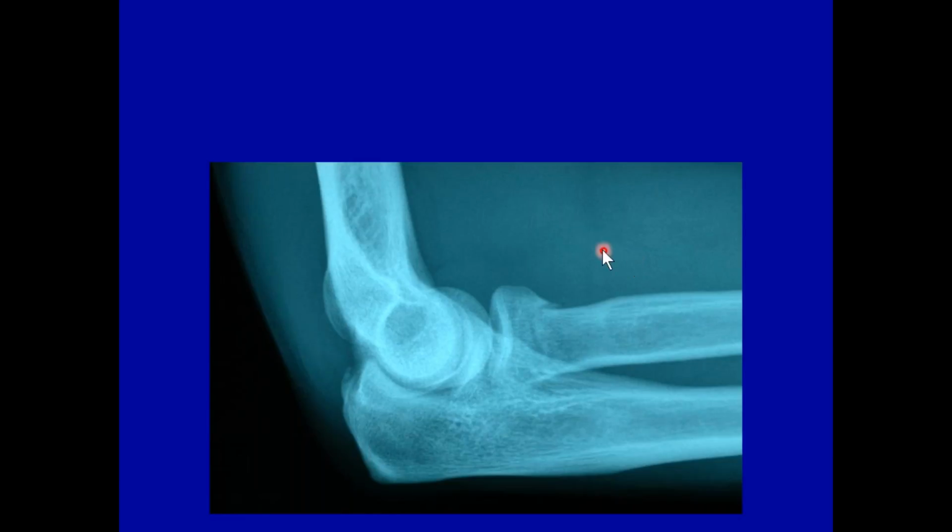Having said that, this is digitally because I excluded the left and right marker, but suffice it to say, in this part of the presentation, all extremities need right and left markers, and unfortunately we're not seeing any collimation. I don't know whether that's when I tried to reproduce it photographically or make it part of the PowerPoint presentation, but your understanding is you'd like to have collimation, certainly in this vertical plane, tops and bottoms.